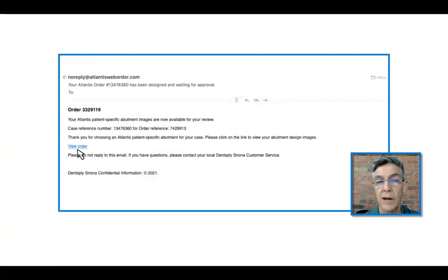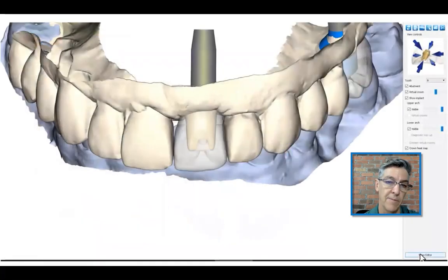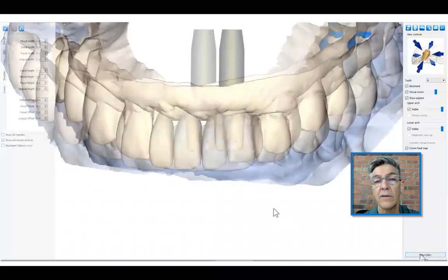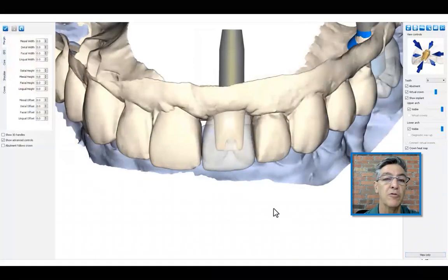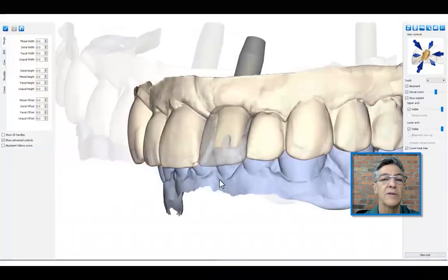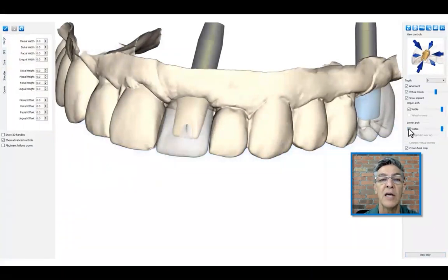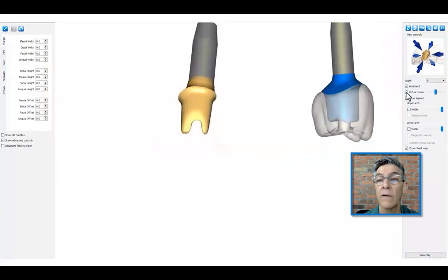In a very short amount of time, the laboratory will receive an email that shows the design done by Atlantis. They can accept this and decide it's all fine, or they can edit it and design the abutment themselves. In the design box, there are options to rotate the image, to flip it, to look at it from any of 360 degrees, but also to eliminate information they might not need at that moment, like the opposing arch, the actual arch, or the planned restoration.